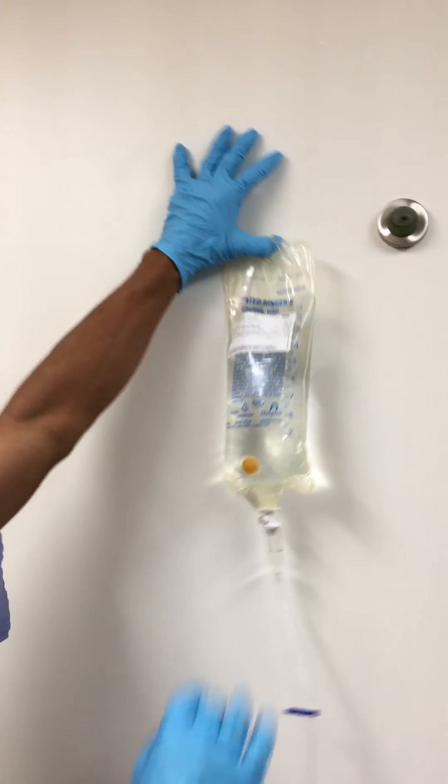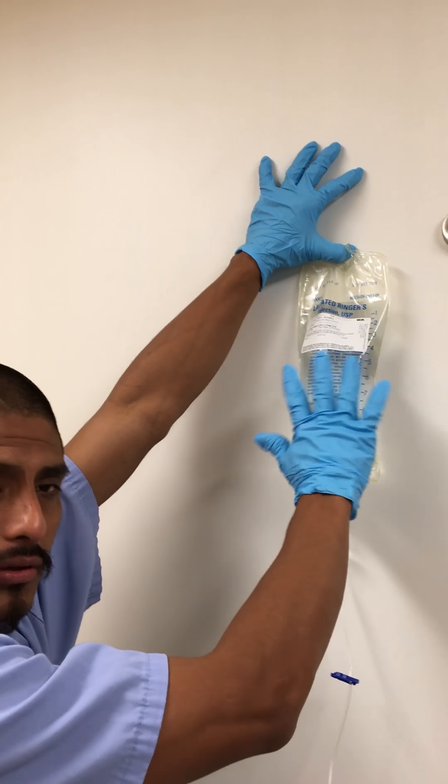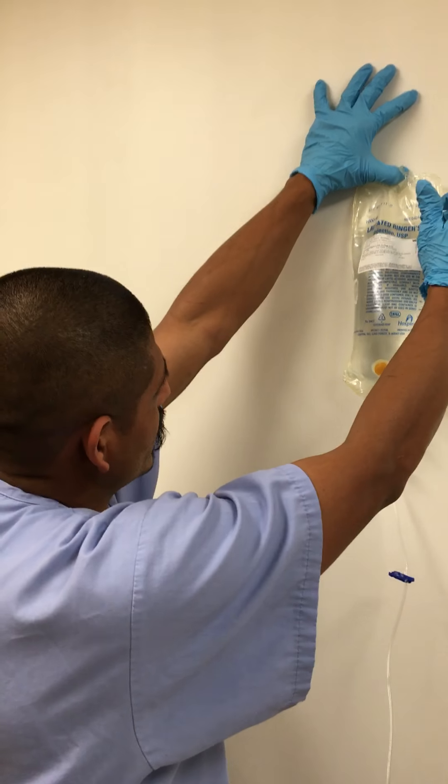I'm slow, I'm sorry. No, it's okay. Each number represents 100. Do not move the bag too many or to different places. Just look at this number.